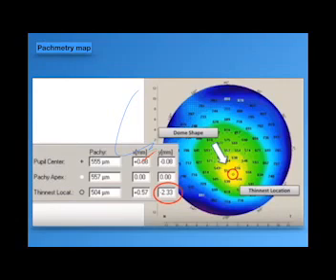Also, we have to study the figures in both eyes to correlate the thickness of the cornea, the thinnest location in the right and left eyes. And the difference should be within a limit of 15 micrometer in some textbooks, and maybe less than 10 micrometer difference between the thinnest location and the thinnest location in the other eye.